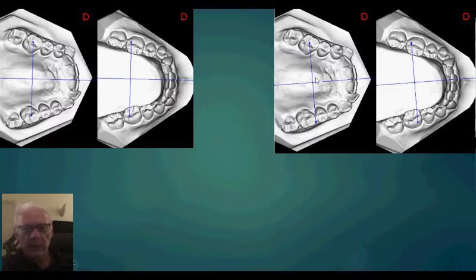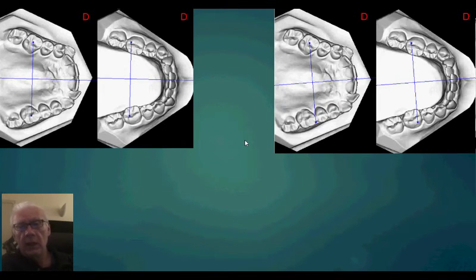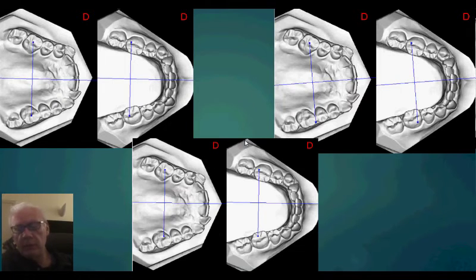It means that you can keep the same anterior reference, but change the posterior so that you will have a sort of rotation of the whole arch. We really don't have the time to explore this topic, which is of fundamental importance in the treatment planning of asymmetrical cases. But I would say that this is beyond the goal of this presentation.